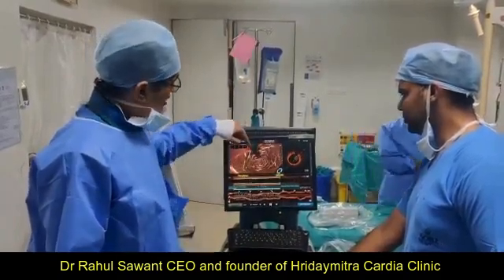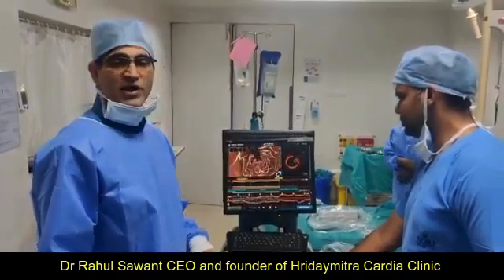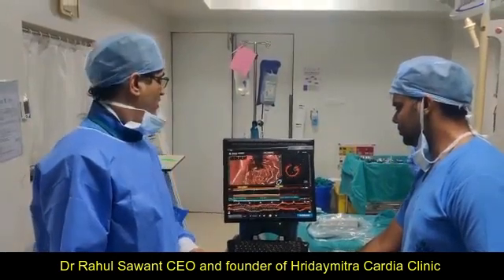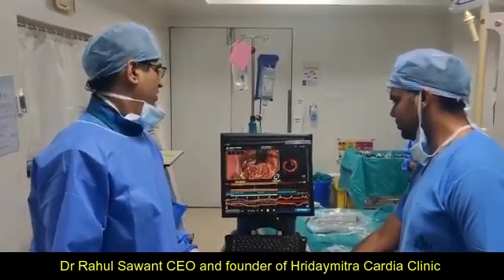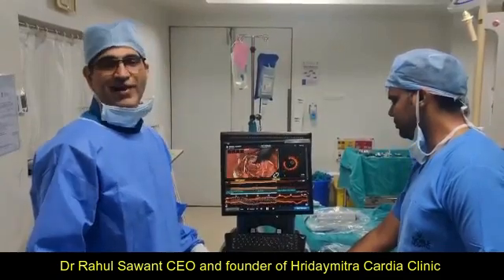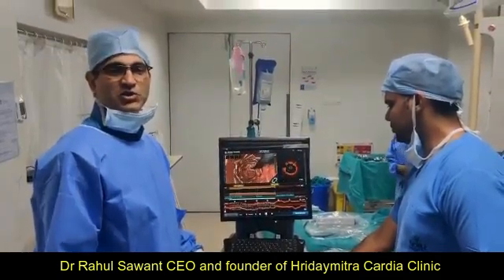What you see at the black portion here is the wire on which we are working. This is a beautiful image. The stent has very well expanded, and we have got excellent results using OCT technology today.